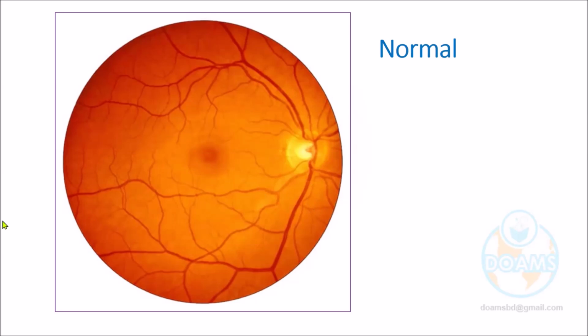Because you are looking at the eye obliquely, focusing from here. I am moving the cursor from here. So you are looking at the optic disc, and this is the central part of the fundus when you look at it. And this is the macular area. So the optic disc lies medially and the macula lies laterally. What is the background of the retina? Is it black, white, yellow? What do you think? Reddish yellow. Reddish or yellow, whatever you say.